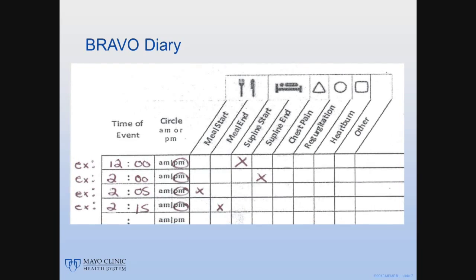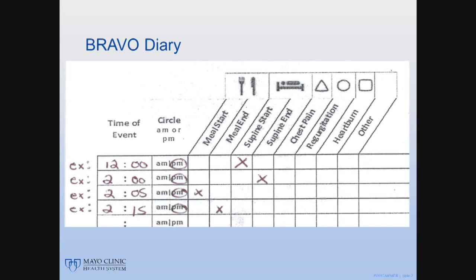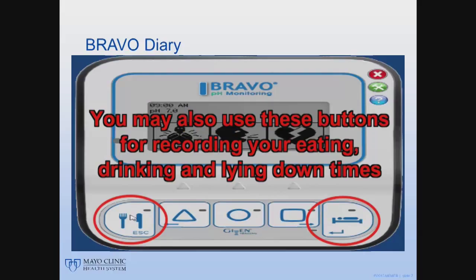Your record of the time and activity helps in determining the degree of your reflux and when it is occurring. Use the clock on the monitor when recording when you eat or lie down. It is vital to use only that clock and not your watch or other clock to record the information. If you remember, you may also use the buttons on the recorder to record your start-stop times for eating, drinking, and lying down.